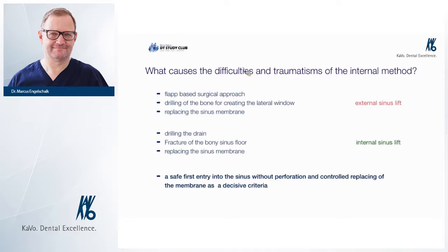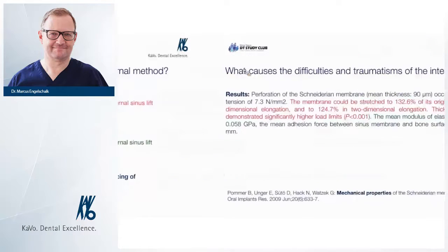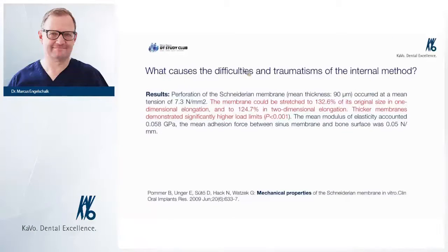We have the complication on top for the flap, for using a membrane, or the internal way. We have the problems of an uncontrolled lift, and we don't have any feedback system and limit. So there should be something else. Here you can see a window we created with a burr. It's okay, but it's invasive.